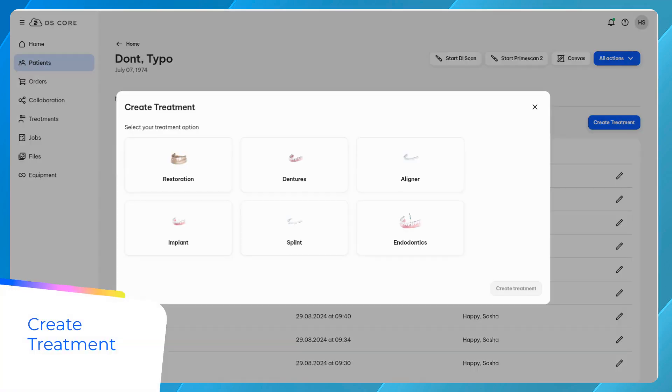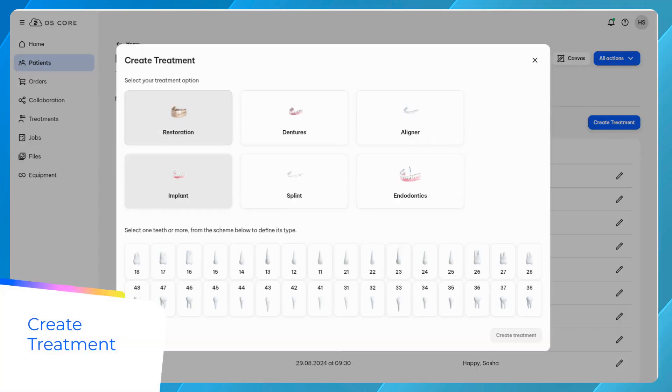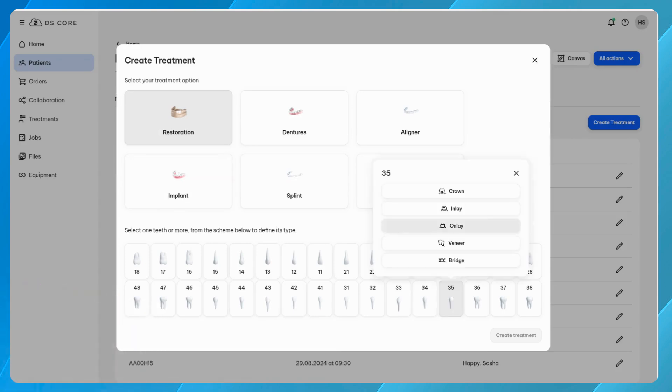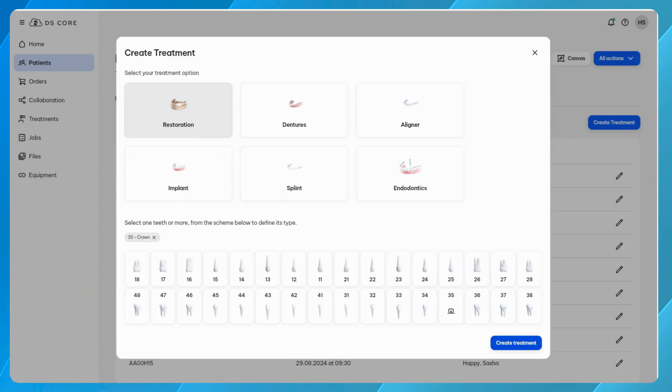Begin by creating a new treatment from the media library of your patient. Now you need to define the treatment. In our case, we're planning a crown on 35.